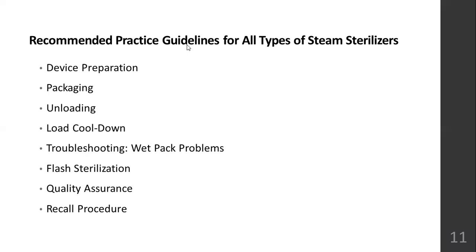Articles that have undergone regular sterilization can be stored for a specific period of time. They have an expiry date. After that, it cannot be used. But flash sterile articles are used immediately, soon after the sterilization. You cannot store them like regularly sterilized articles.